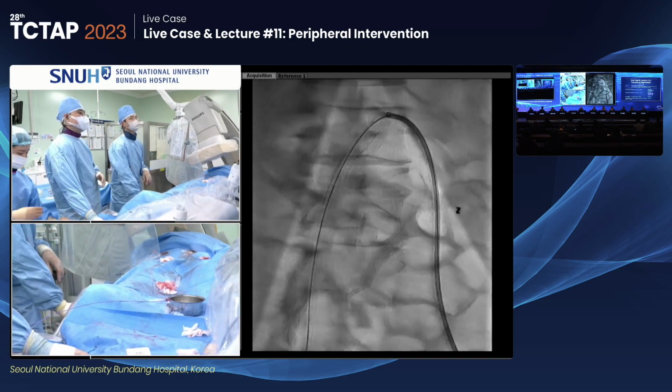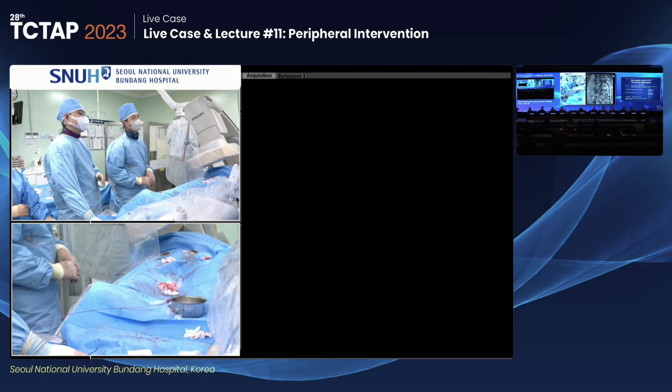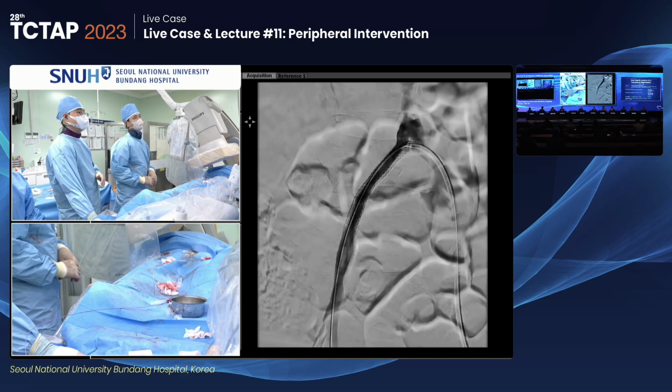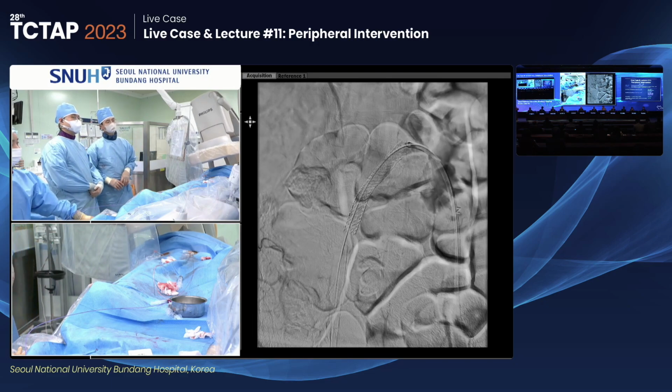For how easy that thing started out looking to where we are, that's a testimony. Congratulations. Okay, there's no complication. It seems good.